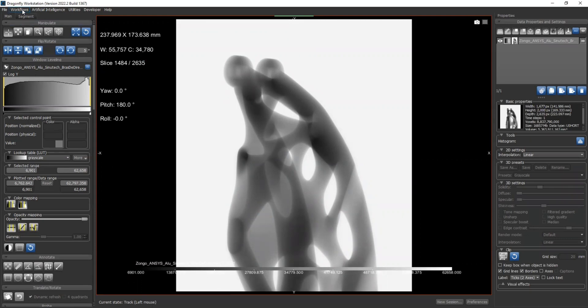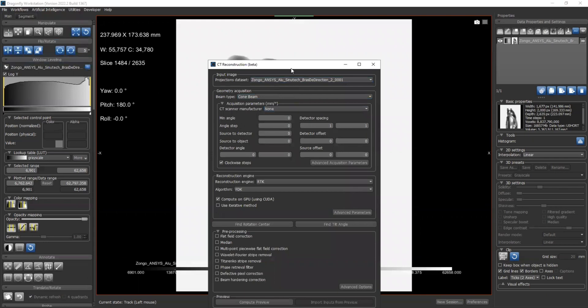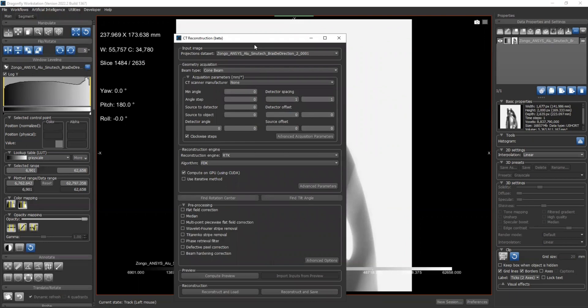Okay, so the second step - we can start our CT reconstruction plugin. Go to workflows. You can select CT reconstruction beta version. So this is the dialog for our CT reconstruction plugin. For the projection dataset, select the dataset you just loaded. Our dataset has been automatically selected because this is the only one.